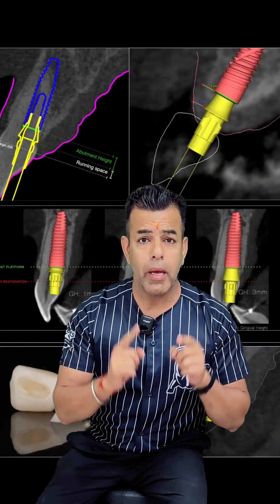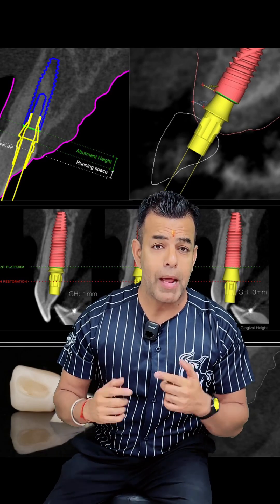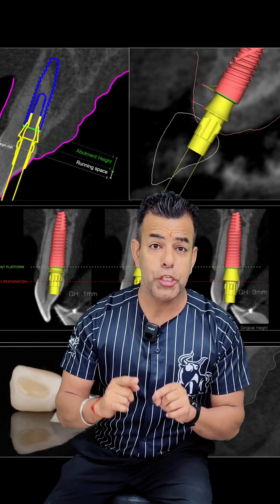The concept is immediate single tooth replacement with loading. You have to place a longer implant, relatively deep and palatially inclined, using a customized abutment to guide the GBR into the bone away from the cementation space. You have to apply the one abutment, one time concept to protect the soft tissue.